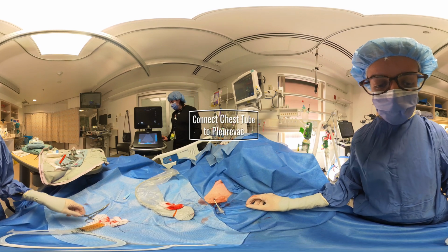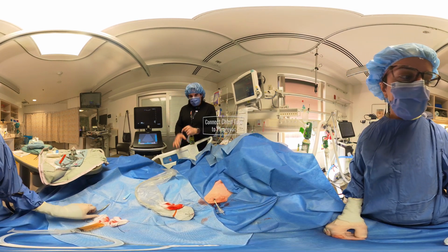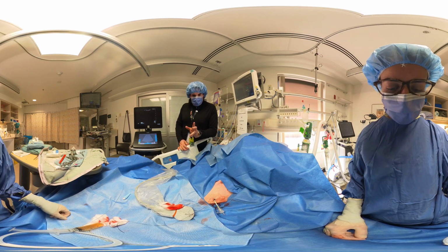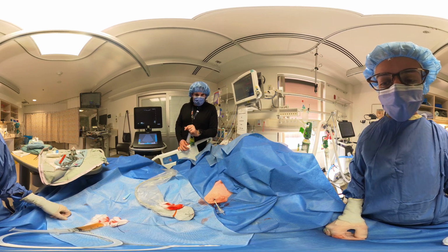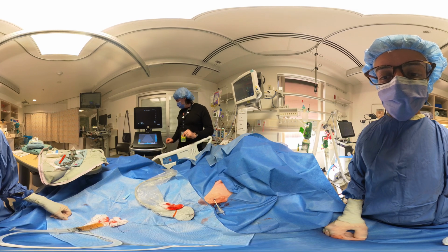Excellent. Okay. So yes, now we'll connect to the Pleur-evac, and then we are done. We'll get a chest x-ray. Again, we only drain about 1.5 liters at max at a time, and then we wait 6 to 8 hours before unclamping again. Okay.